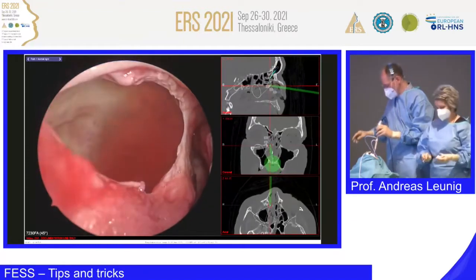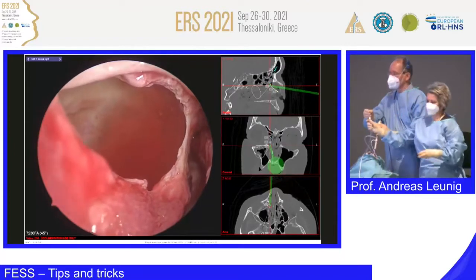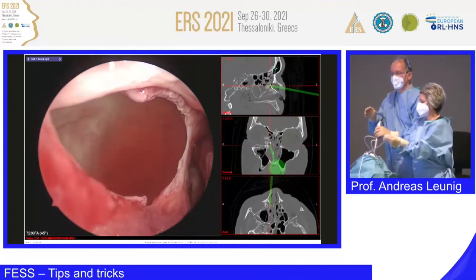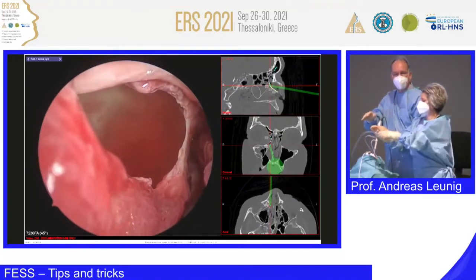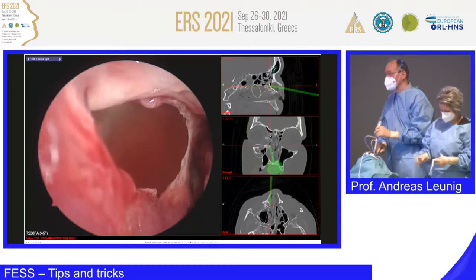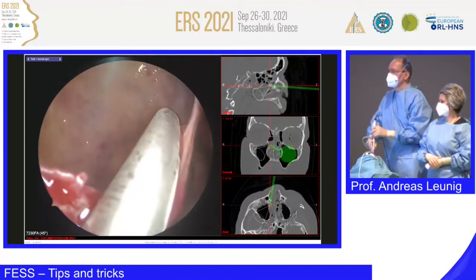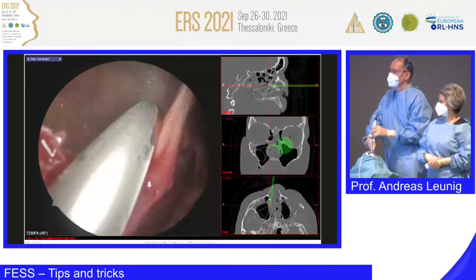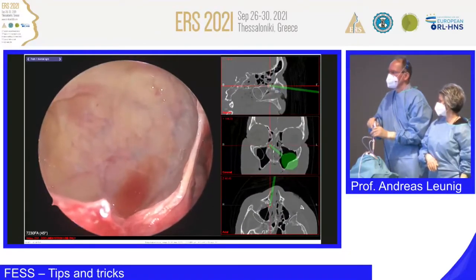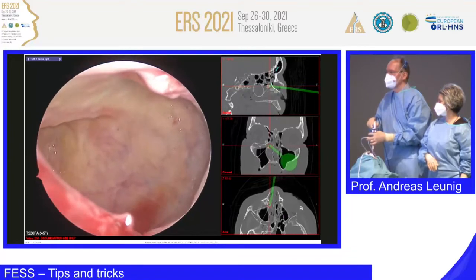So, can we turn on a suction? The curved one. Now I go in and I clean the maxillary sinus. When we were starting today at around 11 o'clock, we had an icy specimen, so it was still ice in all the cavities, and we got hot water, and then we were melting all the ice away, and here should be fine now. You see, I'm going in, and I can clean everything. The only thing is maybe you cannot reach the alveolar recess properly, but you even see lymphatic vessels, the white ones, and the run of the infraorbital nerve.